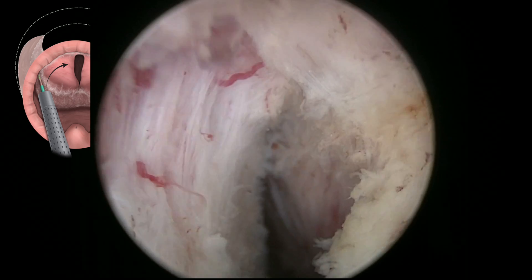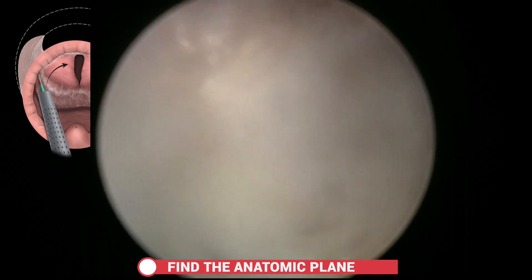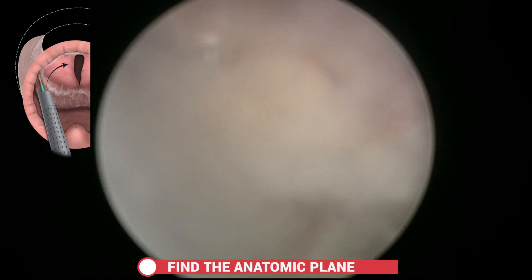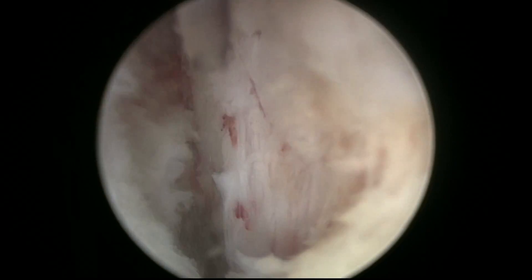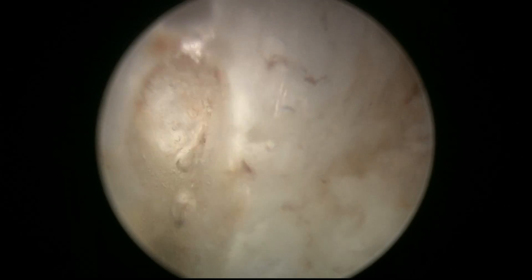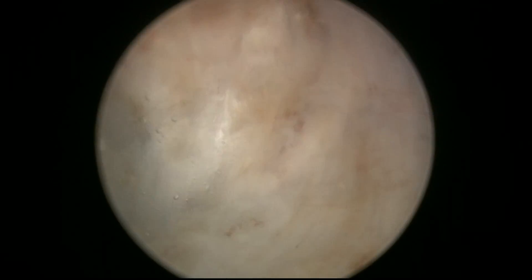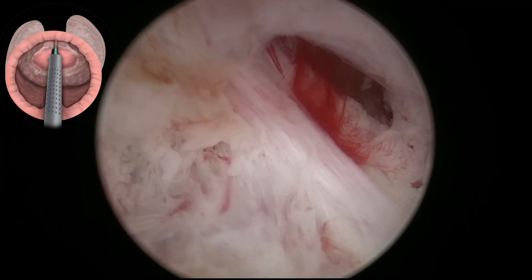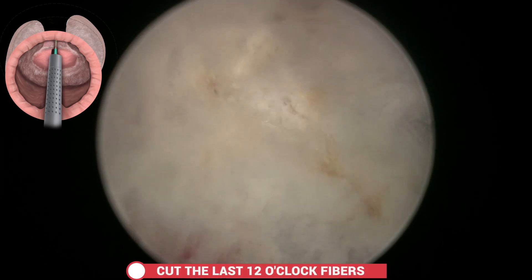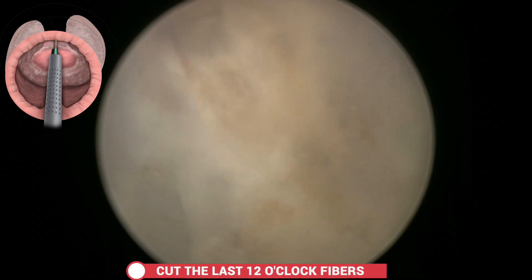Then we go back to the apex, cut into the white line to deepen it, and seek the correct plane to continue the ascending dissection towards 12 o'clock. The idea is to leave only the 12 o'clock fibres to be cut at the end, maintaining a reference on both sides.